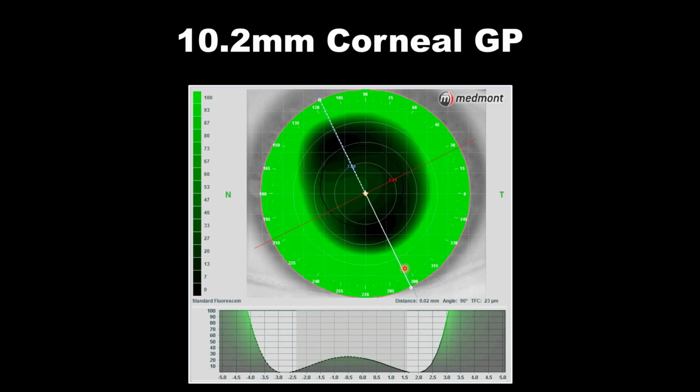But I'm a stupid guy. What if I were to do it just to see what it looks like? And here is a specialty rigid lens designed for the irregular cornea. And you can appreciate the challenge of fitting this patient. With such a tabletop of an eye shape, you see these elevated points where the contact lens wants to bear very far into the center, and you get this grossly wide edge lift all the way around.